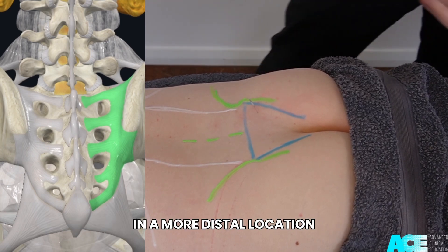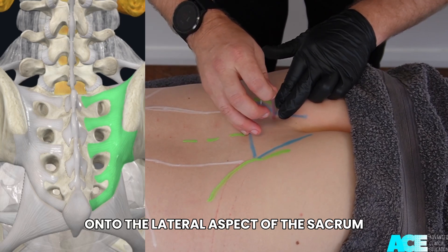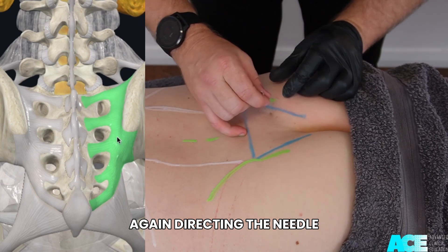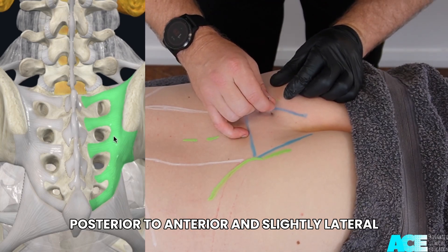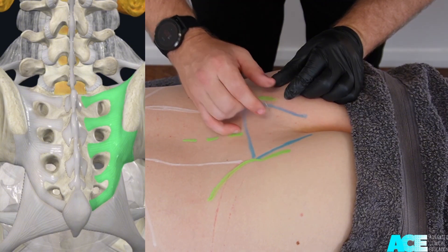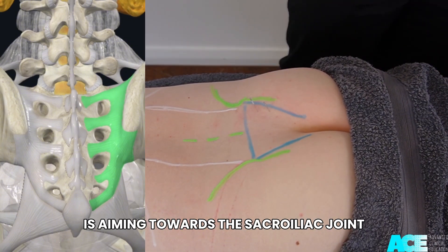In a more distal location, we can roll over the edge of the PSIS onto the lateral aspect of the sacrum, again directing the needle posterior to anterior and slightly lateral. This slight lateral direction is aiming towards the sacroiliac joint.